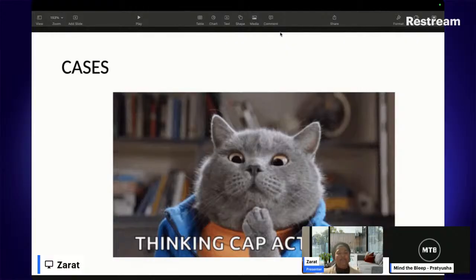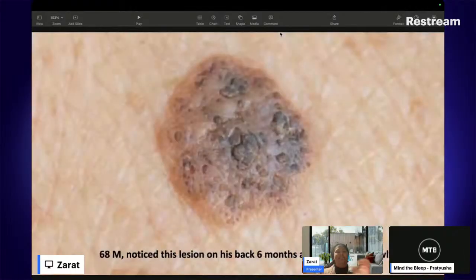Right, so I don't know how many of you are online at the moment, or if you are willing to participate. I have some cases that we can work through together. These are some of the basic conditions we see in the skin. And it will also give you a framework, the kind of framework we use to look at slides. There are lots and lots of nuances to this, obviously. This is just a very, very basic framework.